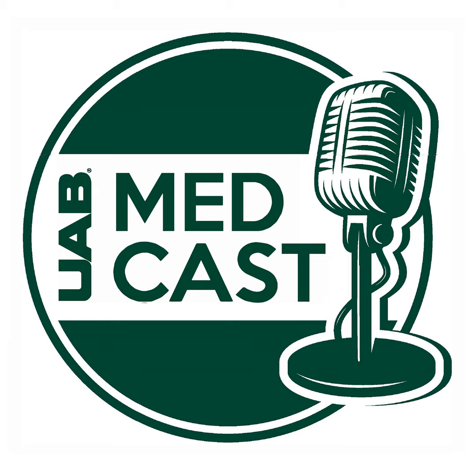Whereas with a subperiosteal implant, the patient gets a CT scan. We plan the subperiosteal implant with an engineer, and we make this implant custom just for the patient. And then when we deliver it, my exposure is less dramatic and more reliable because, again, this was just made custom for this person. That makes it easier for Dr. Case to restore because he was involved in the planning process, so we know exactly how everything is going to look after the operation is over, and it is a less invasive result.